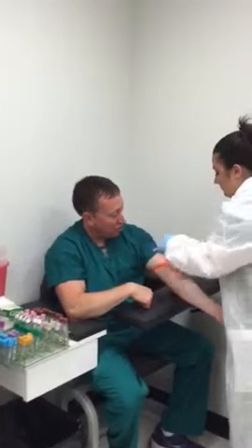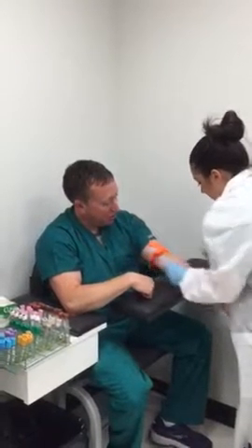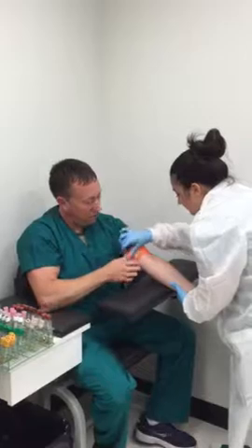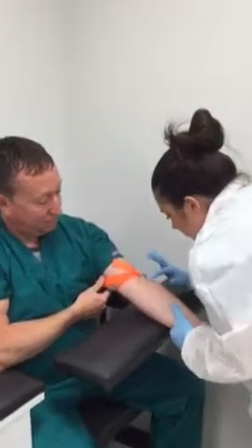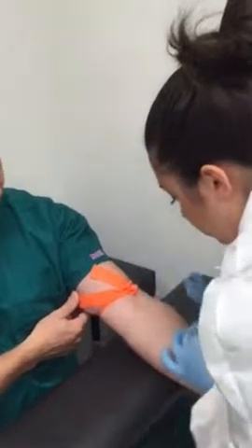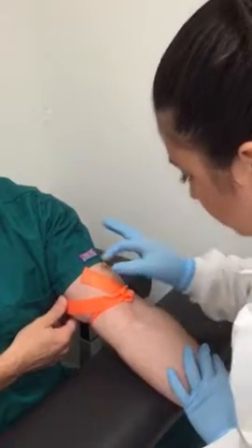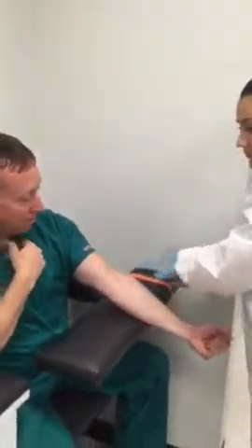Now she's going to put the tourniquet on. Once she puts it on, she's going to go ahead and palpate and make a selection of what she's going to draw. She took the tourniquet off within one minute of being on.